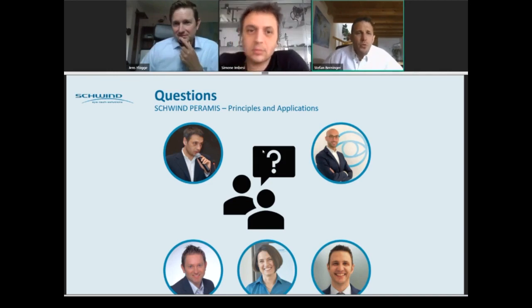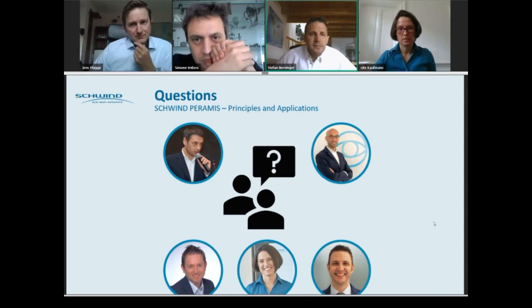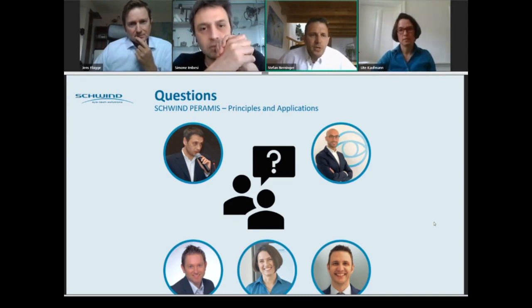The question is, one large spot consisting of perfectly uniform pixels is projected to the retina. Then it goes back to the pyramid as an image of the retina, where it's separated into 4 pictures, which each represent 4 quadrants. So basically, each pixel can be seen from 4 different perspectives, thus measuring its deviation from perfect wavefront. Correct? Yes, correct.